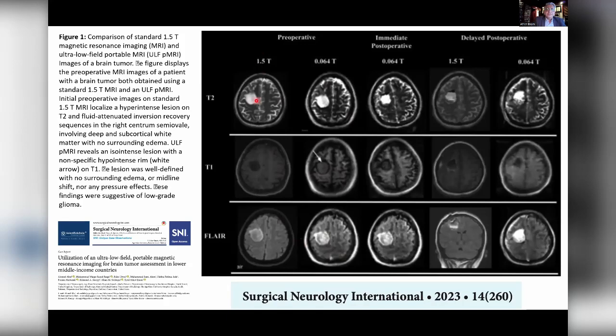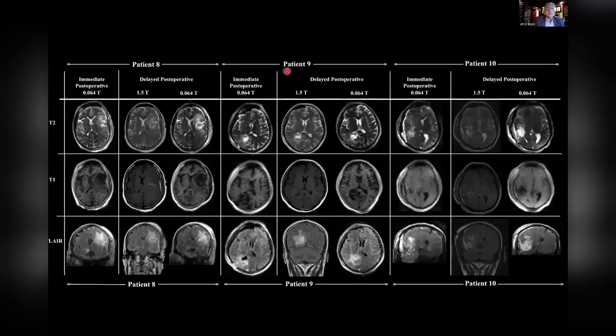So this is 1.5 Tesla over here. This is 0.064 Tesla. This is the post-operative image over here. I'll show you more images. There are some different patients, and this paper is getting prepared for that purpose. This MRI is used for a lot of other purposes. For brain tumors, we are the first ones using it, at least in this part of the world outside North America. So we are trying to put it all together and publish.